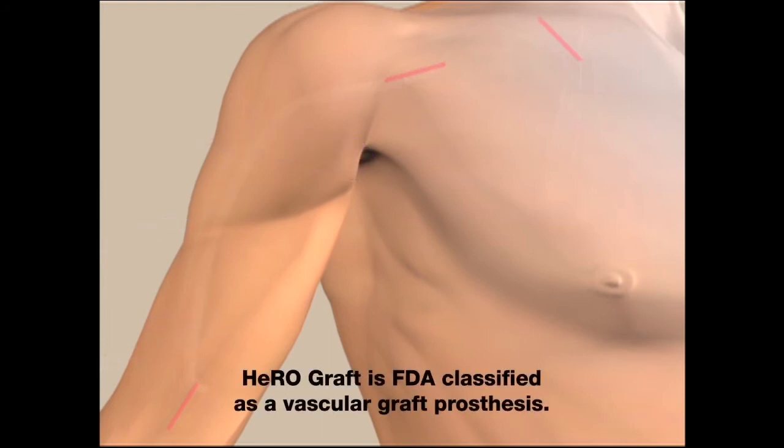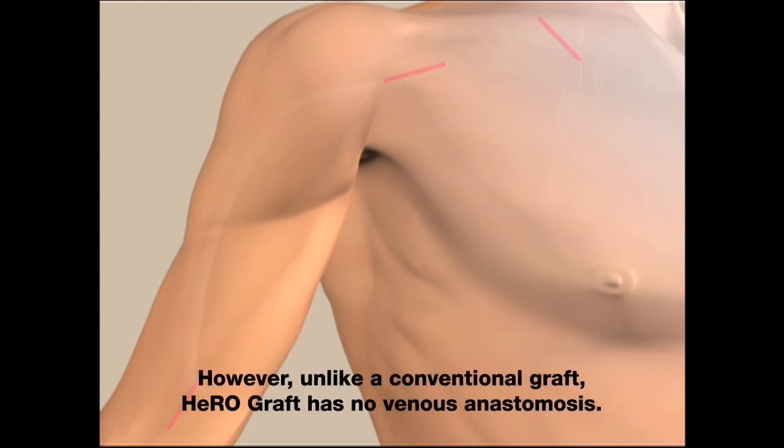HeroGraft is FDA classified as a vascular graft prosthesis. However, unlike a conventional graft, HeroGraft has no venous anastomosis.